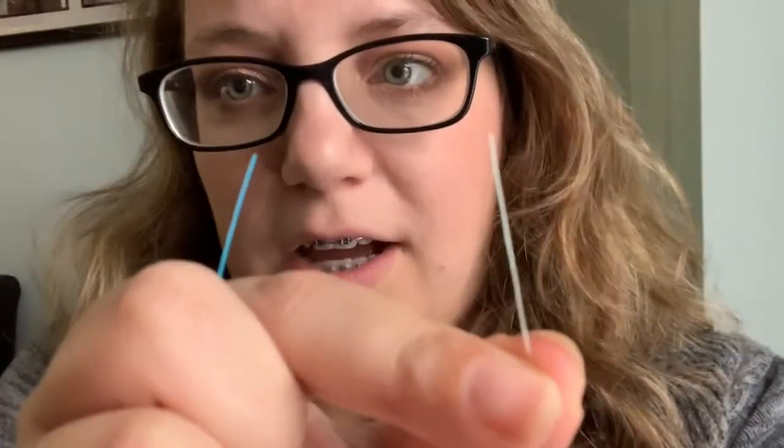This little piece is the exact same kind of material as the end of the super floss. So you've got your super floss here, and you've got your threader over there. It literally feels the exact same. It's very stiff feeling so that it can easily get through the bracket, the space, the wire, and then the threader just pulls the dental floss with it to clean, whereas this is all in one. So I do tend to use the super floss more because it's easier. I don't have to worry about tying off a piece of dental floss to it. It's just all in one, so it does make it easier. But I just thought I'd hop on, show my little travel kit, and give a nice little update.